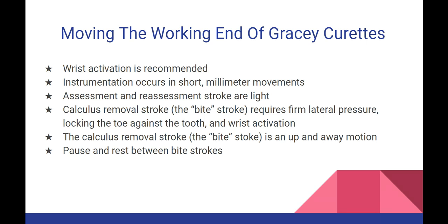Moving the working end of the Gracey curettes. Wrist activation is recommended. Instrumentation occurs in short millimeter movements. Assessment and reassessment strokes are light. Calculus removal stroke, the bite stroke, requires firm lateral pressure, locking the toe against the tooth, and wrist activation. The calculus removal stroke, the bite stroke, is an up and away motion. Pause and rest between bite strokes.